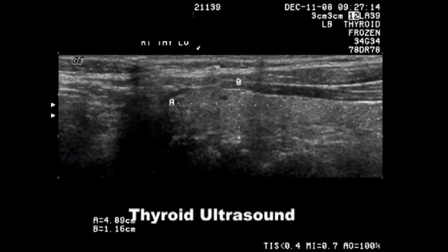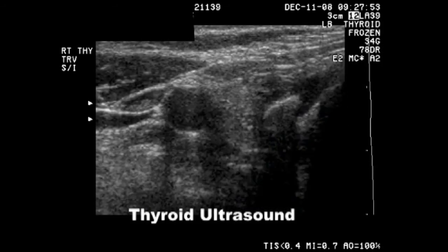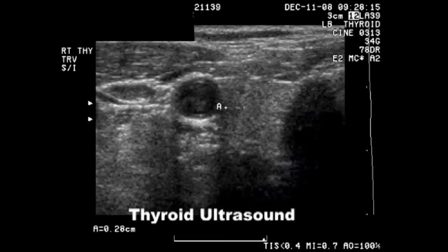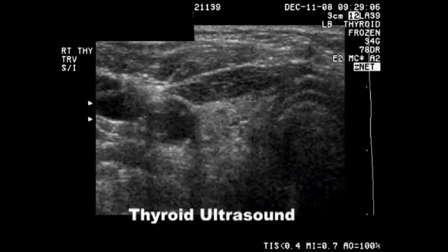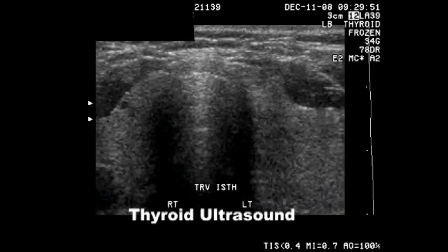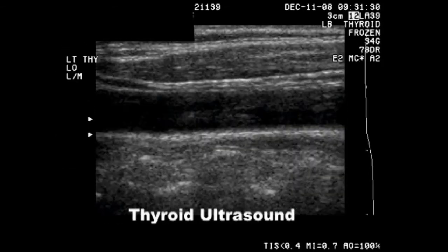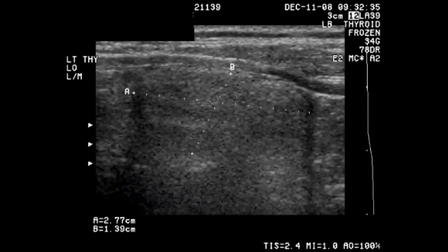This is a thyroid ultrasound. The first 20 seconds consists of a movie made of multiple images linked together. As it progresses, we'll point out some of the various pathology which is seen.